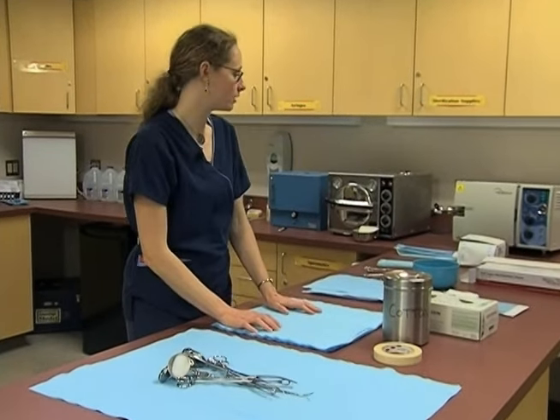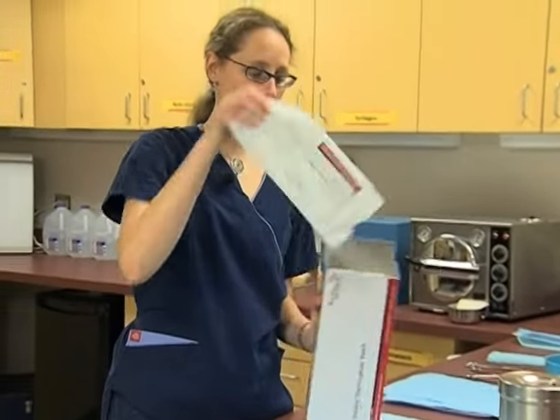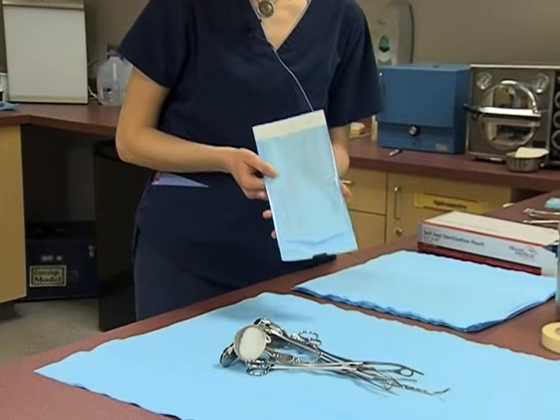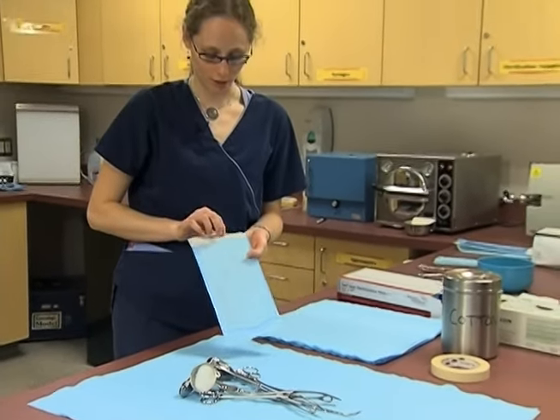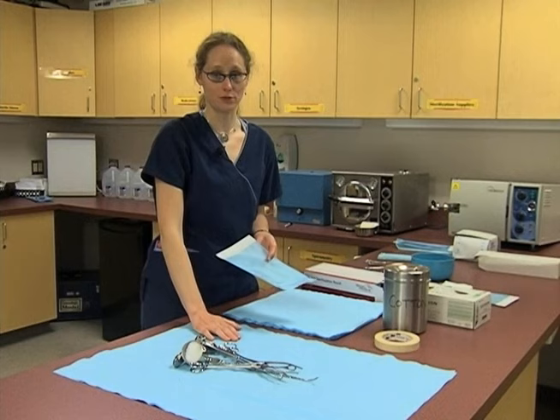And other things that we can use that some offices prefer are pouches. And they come in a variety of sizes. They're very handy to use. And as you'll see later when we do wrapping, this is a lot easier option. These are a little bit more expensive, but what's also nice about it is you can actually view the surgical tools after they've been autoclaved, where we cannot view the tools after they've been wrapped.